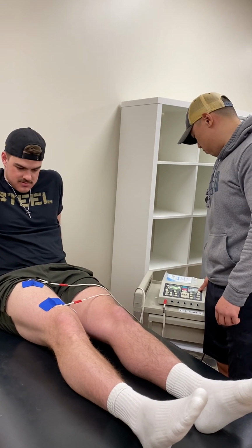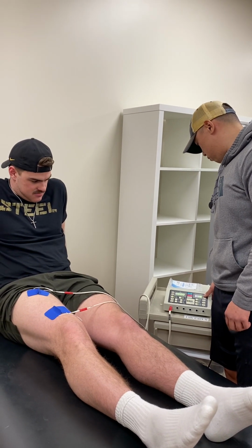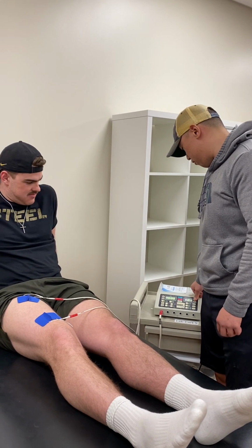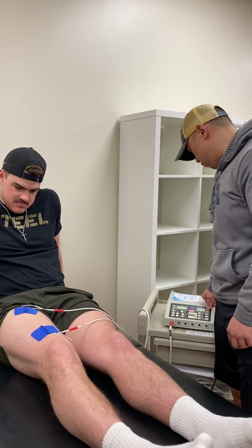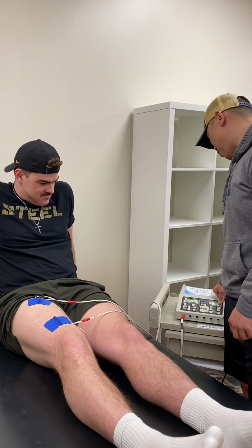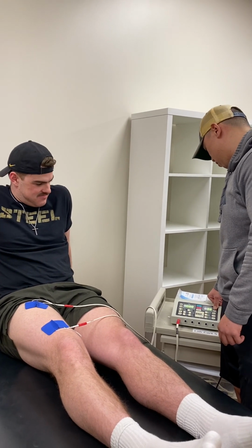Okay, keep going. Still kind of tingly. Keep going. It's almost there. All right, that's probably good.